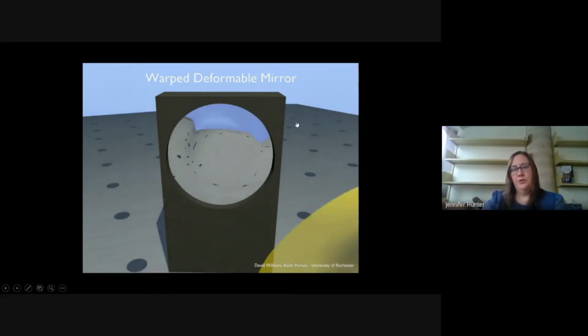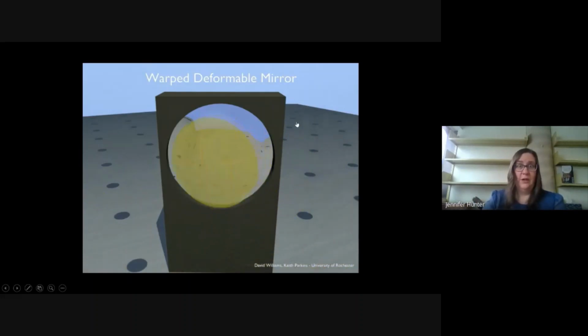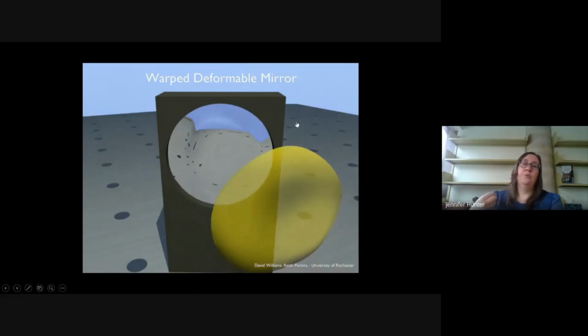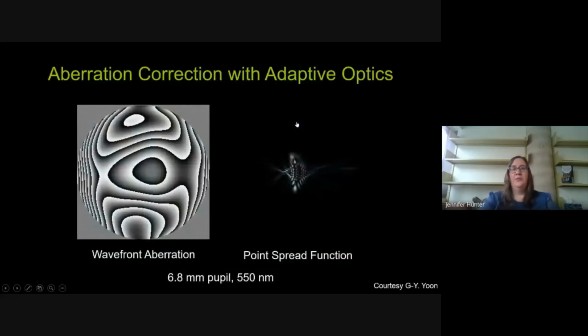And so by measuring and correcting, we can correct then both the ingoing light and the outcoming light of the eye, so that what we do is we have the best looking spot on the retina by pre-compensating for the aberration. So actually aberrating the beam going into the eye, so the eye's aberrations correct the spot on the retina. And then on the way back out, we recorrect again in order to actually correct the spot that would be coming back out of the eye and heading into our detector. And so with that, we end up with an aberration correction.